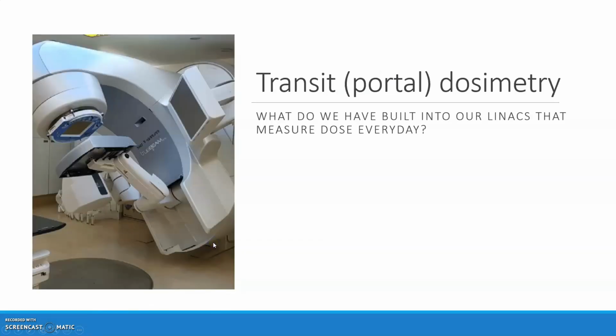Okay, so in this next part of the session, we're going to move on to transit dosimetry or portal dosimetry. And the question we need to ask ourselves here is, we've got something on our Linacs that allow us to do this without any significant additional cost and time. And of course, it's our amorphous silicon EPID panel that we can use. So let's have a look at that.